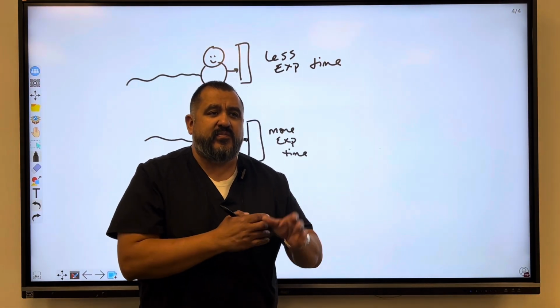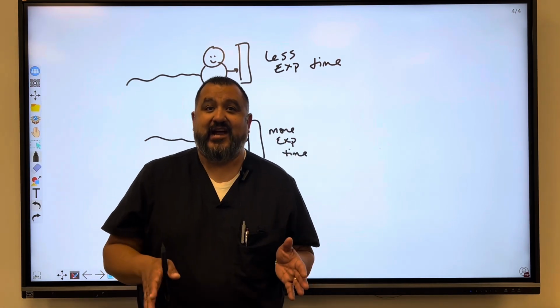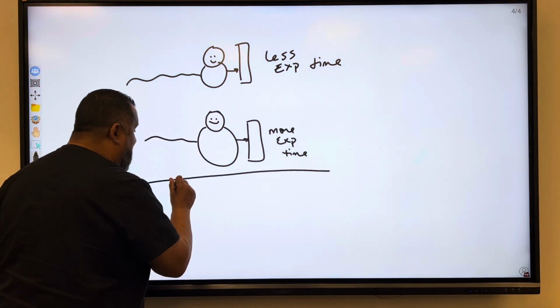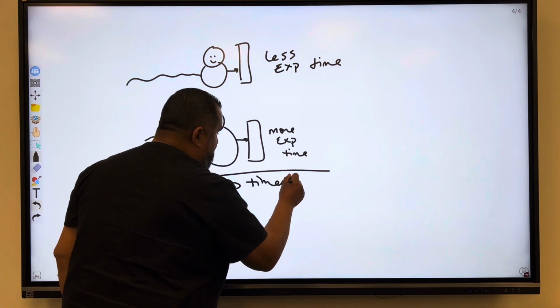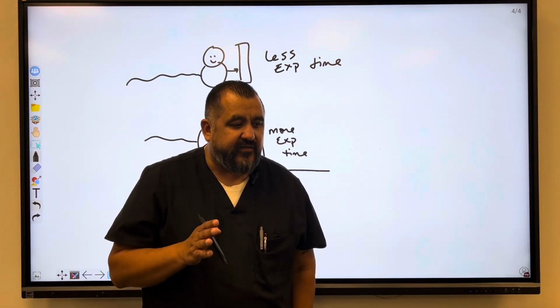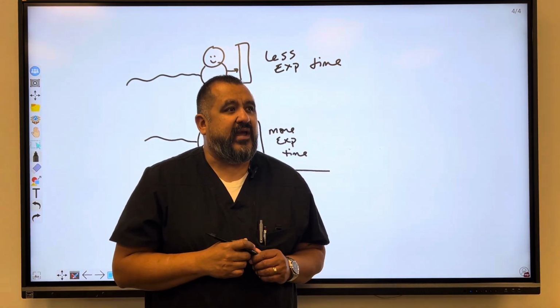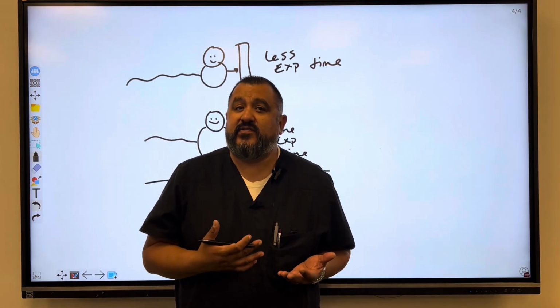So some people have said, but Mr. M, what if the system keeps going? Well, that's where you have backup timers, okay? So there are backup timers with these AEC systems. Backup timers are preset, and they're usually about 150% of the anticipated mAs. So let's say you're going to do a lumbar spine, and you're going to use 40 mAs for the lumbar.